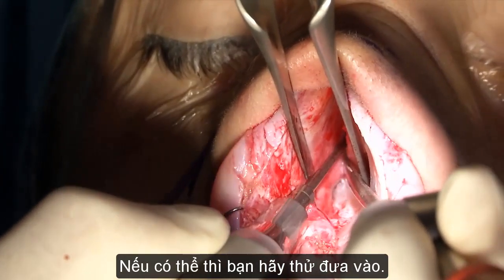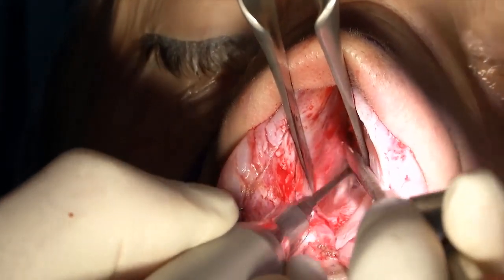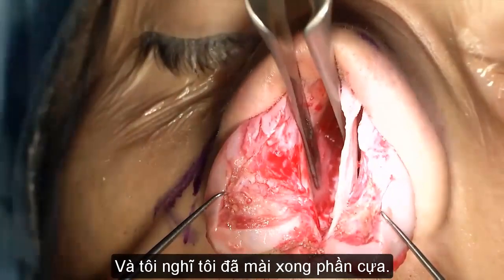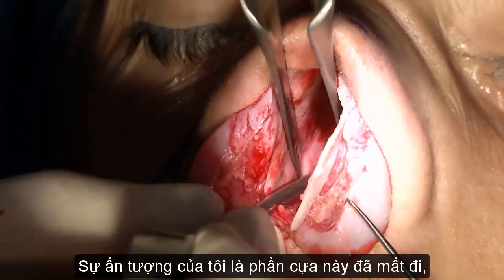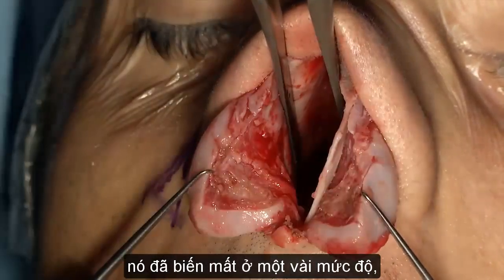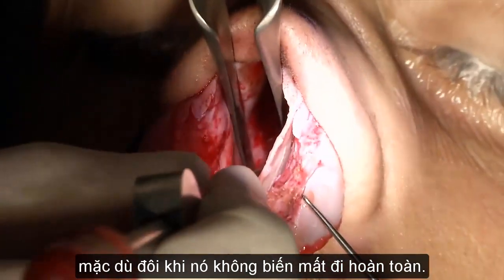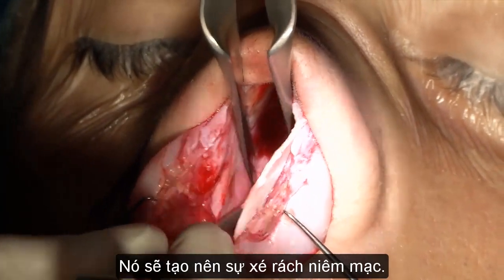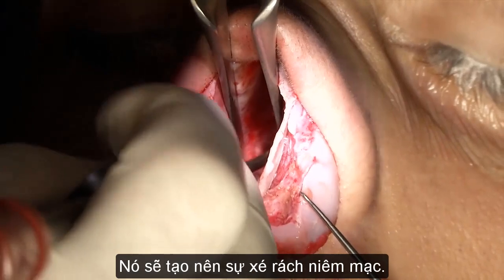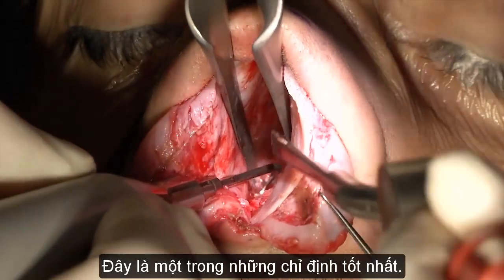So, if possible, you can try and come in. There we go. Okay. And I think I already did it, since my impression is that this spur is out already, although it's out to some degree, it's not out completely, of course. Oftentimes this will cause a mucosal laceration. This is one of the best indications for piezo, really.